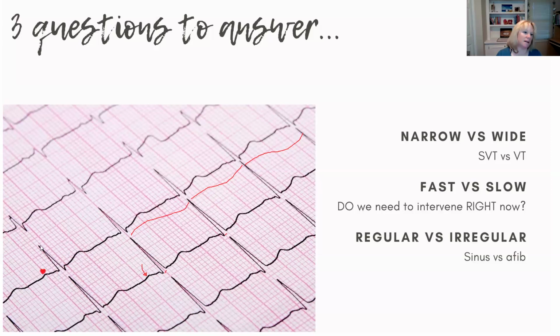You should have a P, a QRS, and a T, and they should all be following the rules we talked about last night. The P shouldn't be too tall or too small. The QRS shouldn't be too tall or too small. The P shouldn't be too close to the QRS, and if it is, it means WPW is likely. And the T wave shouldn't be running away from his dad, prolonged QT, and he shouldn't be too tall, ischemia or hyperkalemia, and he shouldn't be too small, hypokalemia is usually the cause of that.